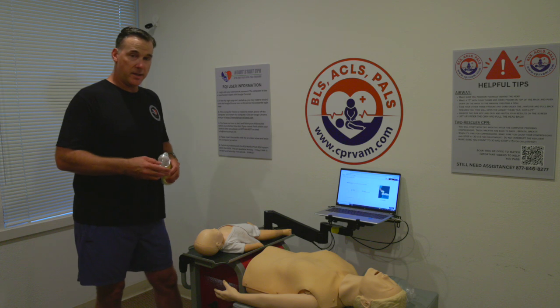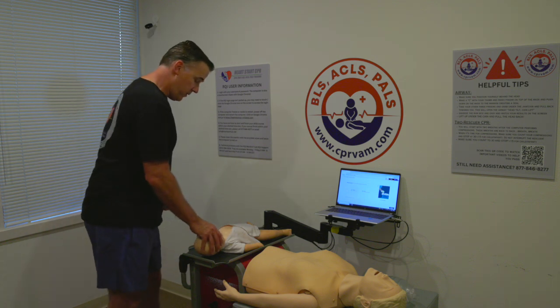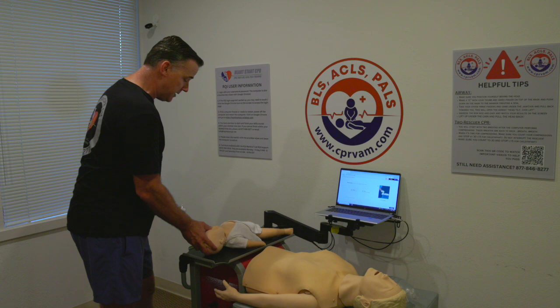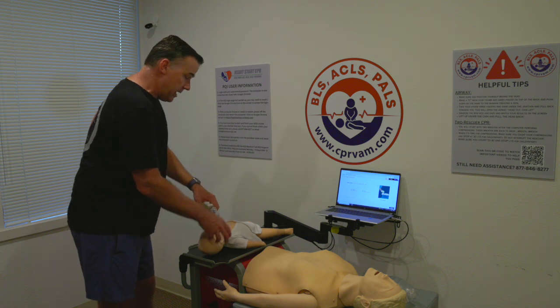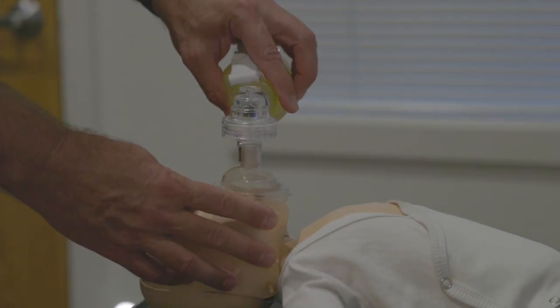The next skill we're going to do is infant breathing, again with the bag-valve mask. An important thing is making sure that we have the head tilted back a little bit — not as aggressive as the adult, but we want a nice neutral position. We're going to tilt the head back a little bit and get a good seal, almost a small C around and an E underneath.